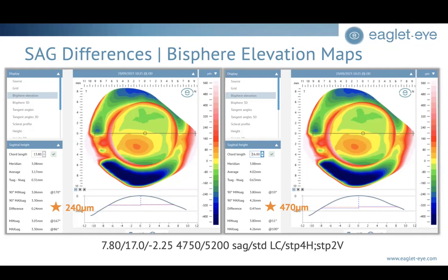That first landing point, or first touch point on the eye, can be affected by elevation height. So an eye that's perfectly symmetrical right around the limbus is going to be just fine with a lens shape that lands equally all around that space. Now, what the software allows us to assess is, are there differences in the landing from that space where the lens lands all the way out to the landing zone on the sclera at a broader chord? It also allows us to take different cross sections and look at the height of the eye, not just in one meridian and assume it's the same all the way around, which it isn't.